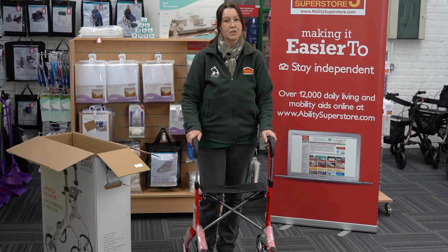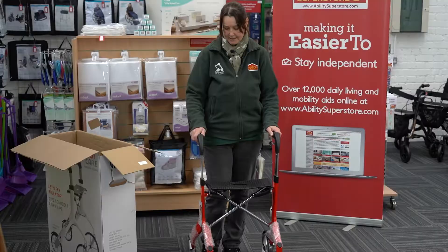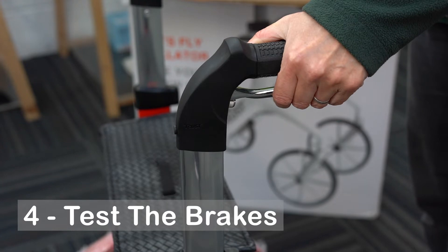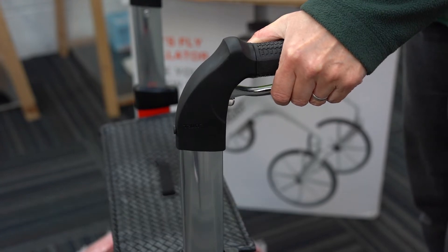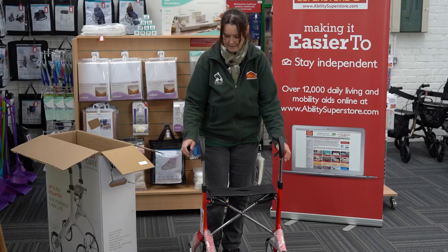Once you've got it at the right height, you'll notice how comfortable it is to use - that's because it's got built-in suspension. It's also got brakes: you can squeeze by pulling them up and it stops in its tracks, or if you want to stop properly you can click them down, one on each side, and that locks it in place.